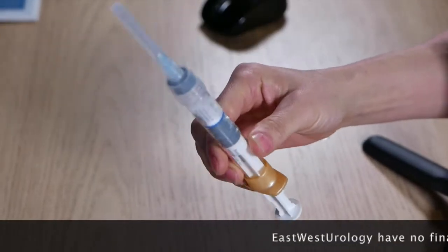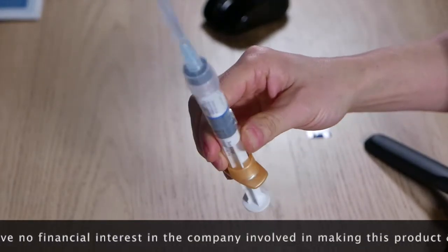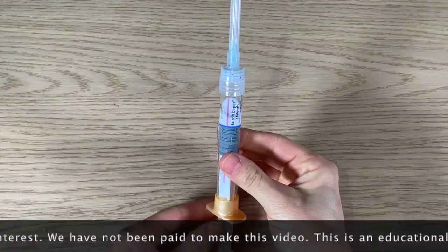At this point all the powder needs to be mixed with the fluid by gentle agitation of the syringe. Keep mixing until all the powder is in solution — it does not clear completely, but no powder should be visible.